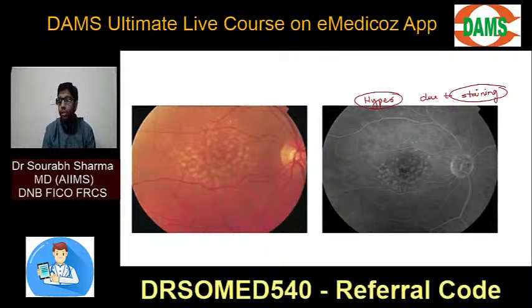So how does the question come to you? Clinical scenario: an old patient comes to you. There is a problem in the macula. Distorted images, metamorphopsia. An old patient comes with vision loss, with metamorphopsia, with drusen. It is age-related macular degeneration. This fluorescence angiography picture usually won't be asked in your exam, but just for completion I'm telling you, this will also be hyperfluorescence. Drusen will be hyperfluorescence due to staining.